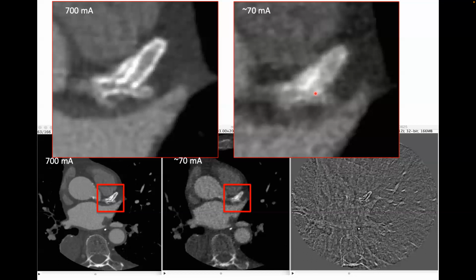If I rotate the mouse, then I've got a whole bunch of projections, and the spatial resolution of those projections is very high. Why? Because we have an X-ray source that has a tiny spot size, something used for mammography, for example, and I project the shadow up to a large detector. So my geometry is such that I've been able to magnify the image itself, right?